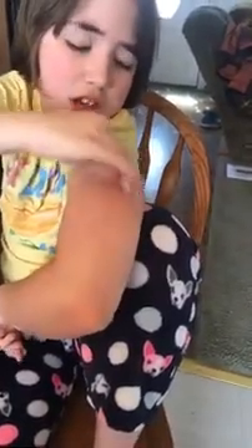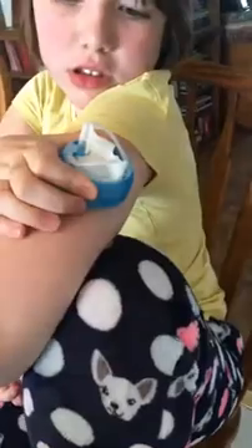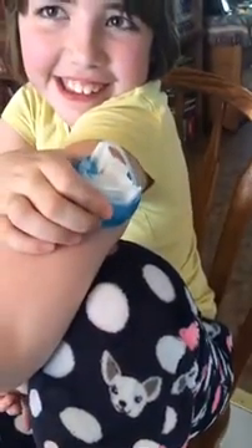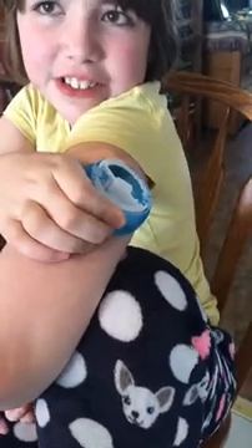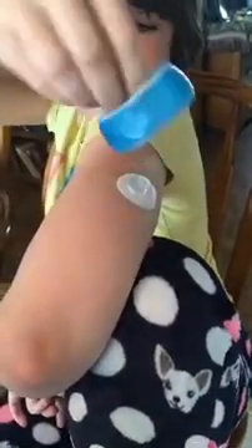What this does is it gives her one site every three days instead of finding lots of different sites every day, and it's helping to reduce scar tissue. We've noticed a big change in her arm where there was some scar tissue. We haven't done something on this arm for a while — we were giving it a rest. Make sure it's dry. Then she's going to take that, which is already spring loaded, and there are two little spots on the side that you squeeze. Push down, pull up on the white part — and it's on.